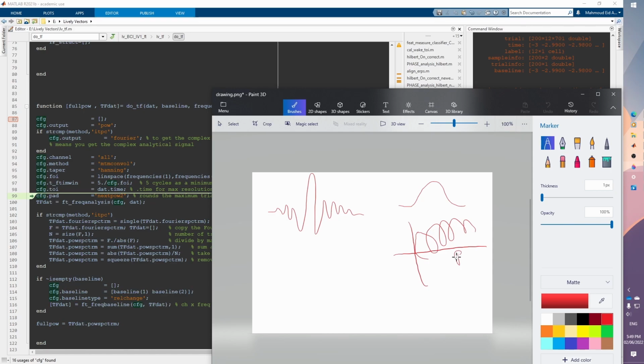If we looked at the real and imaginary progression in time, we would see that this is cosine, and this is sine, and this is progression in time. So we are looking at cosine, and here at i sine, okay, and we can say that this is a complex signal, and we can then taper the signal or apply this kernel by using a Gaussian, and it will look something like this. So these parts will be attenuated a little bit, and here we are just plotting the real part of the Morlet wavelet.